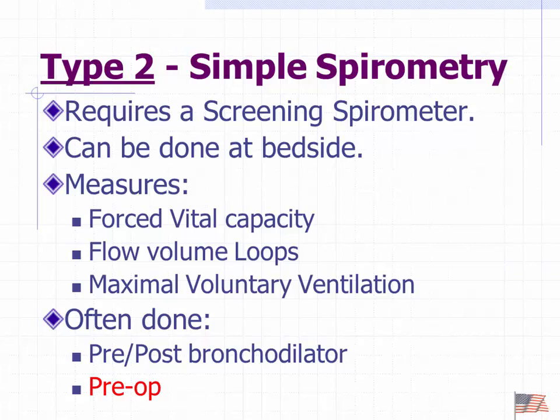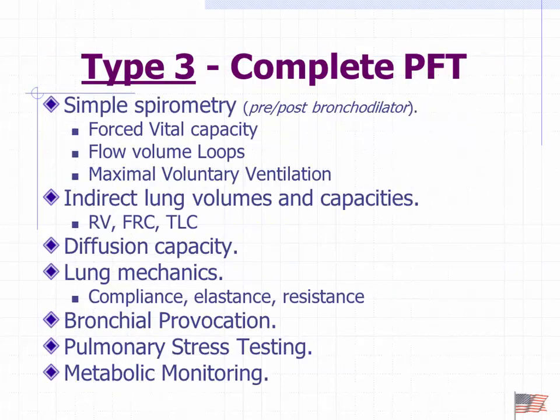Okay. Usually if they're a COPD patient or an obstructive disease patient, we'll automatically do a pre and post bronchodilator. So we'll do a test and then we'll administer a bronchodilator and repeat the test. And again, that's where we're looking for a 12% change in the FEV1 and a 200 milliliter change in the FEV1 to consider it to be a responsive airway.